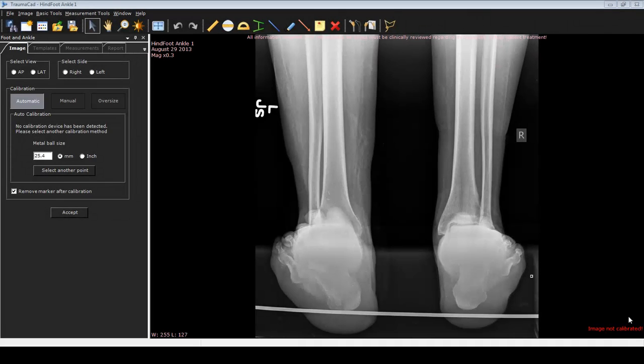This is Dr. Noman Siddiqui using the TraumaCAD software and demonstrating how to use this program to correct a hindfoot varus deformity.